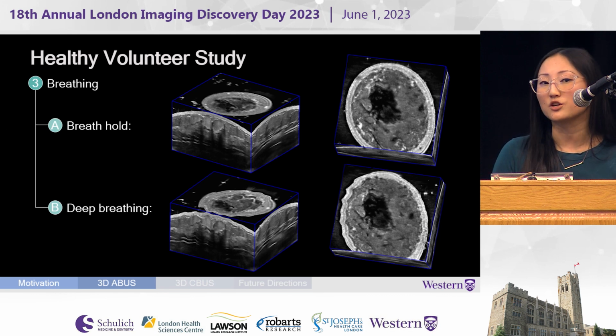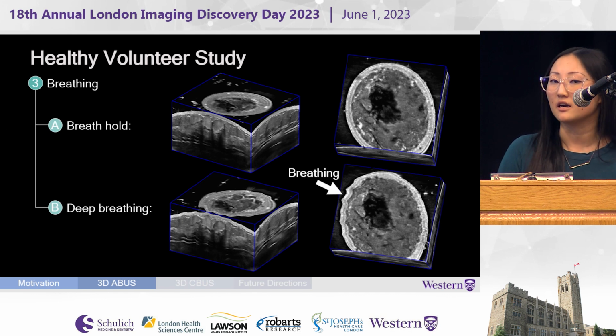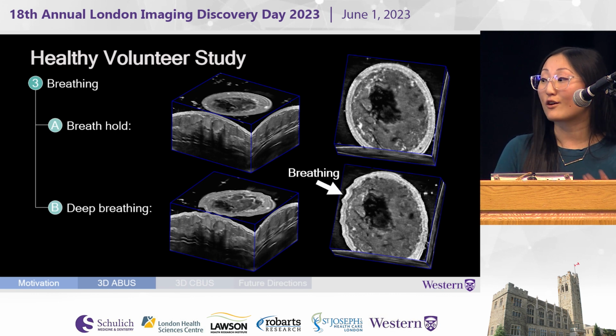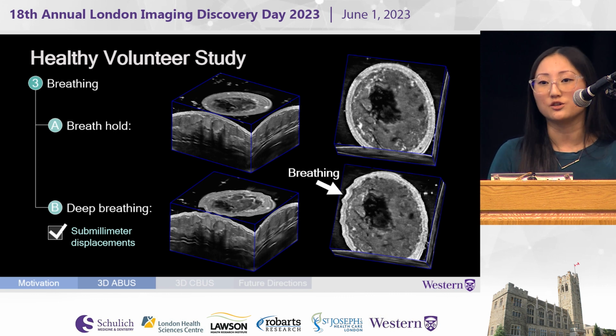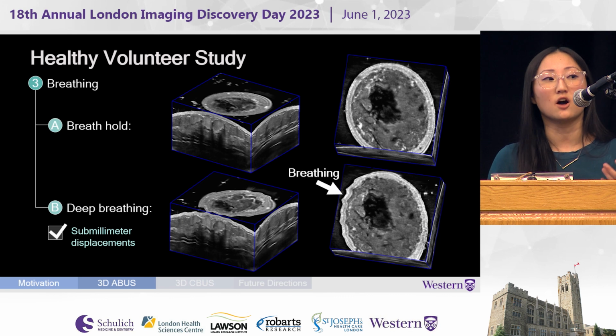So this top row shows the images acquired with a breath hold, and the bottom row shows images acquired with a very deep breathing from full inspiration to full exhalation to really exemplify an extreme case of breathing motion, which is also a more realistic level of motion in clinical practice than the patient moving around substantially. So while this motion did result in very small displacements in the skin and internal structures, these artifacts are still sub-millimeter, which are substantially reduced compared to normal breathing that could be up to several millimeters in clinical practice. And ultimately, this demonstrated the capability of our system to help mitigate those artifacts, since the frame of reference of the system was attached directly onto the volunteer as the volunteer breathed and as the volunteer was moving.